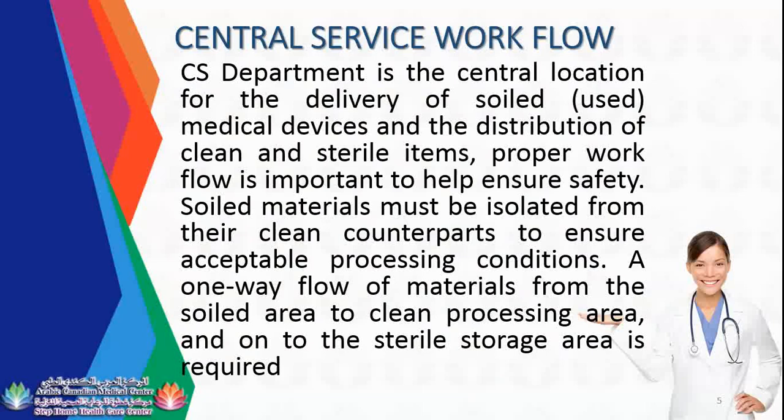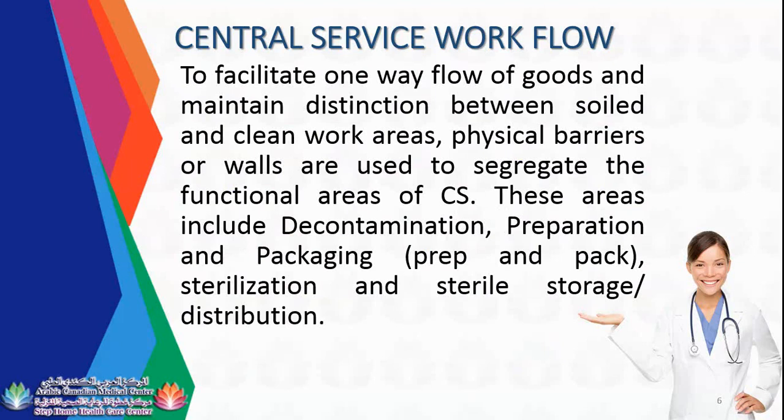sterilization area. One-way flow of materials from the clean processing area to the sterile storage area is required. To facilitate one-way flow of goods and maintain distinction between soiled and clean work areas, physical barriers or walls are used to segregate the functional areas. Actually, they are divided with walls. But if they are not divided with walls, there are air curtains or pressurized air. For the decontamination area, there is negative pressure air.